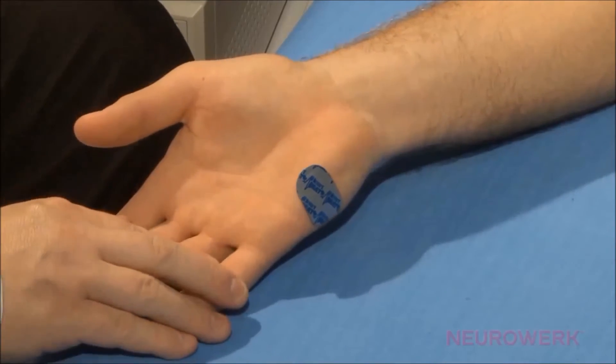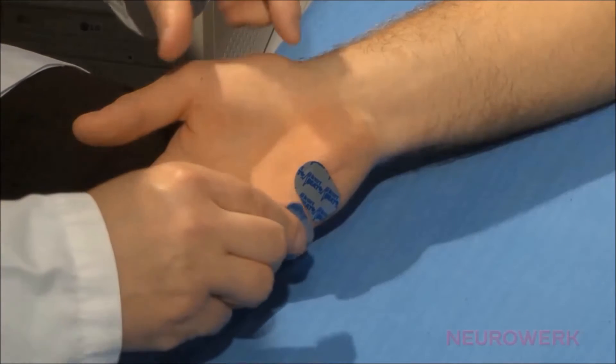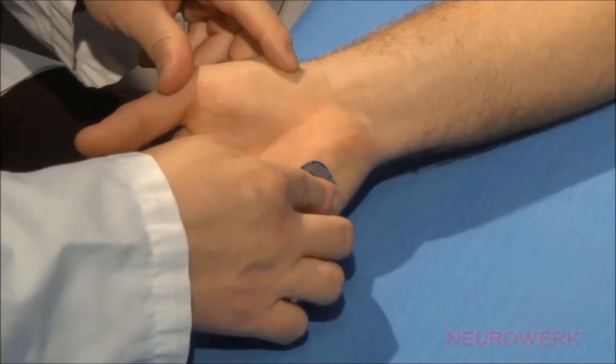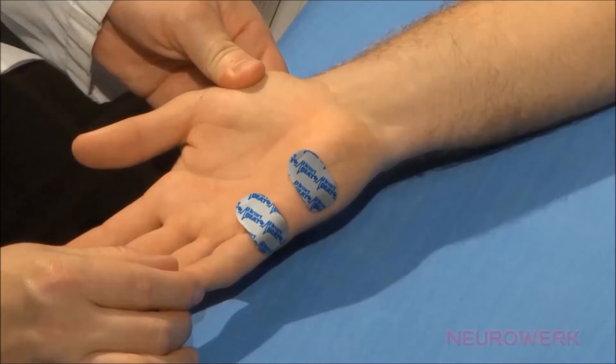The precise electrode position on the hypothenar is determined by abducting the little finger maximally. The indifferent or reference electrode is attached to the anterior little finger joint.